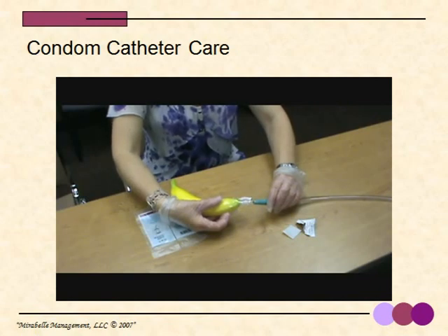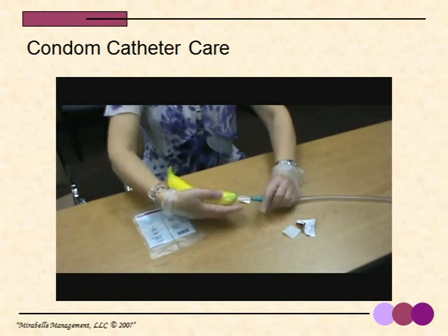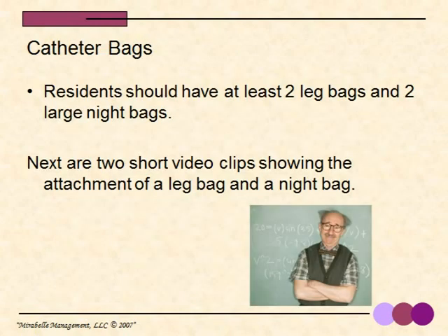Document what you have done. Just as a note, this catheter can stay on for several days. Once a person has showered, obviously it's disposable. They are not reused. It's considered best practices for a resident to have at least 2 leg bags and 2 large night bags to use.